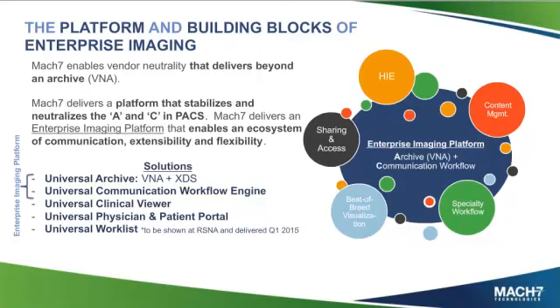So if your front-end PACS only has capabilities of doing a traditional asynchronous DICOM query retrieve, then I would recommend that, with your VNA, you have the proper routing and prefetching algorithm set up. And in addition to that, you're going to need a level of cache underneath that traditional system that holds enough data so that data can be as close to real time as possible for the physicians.